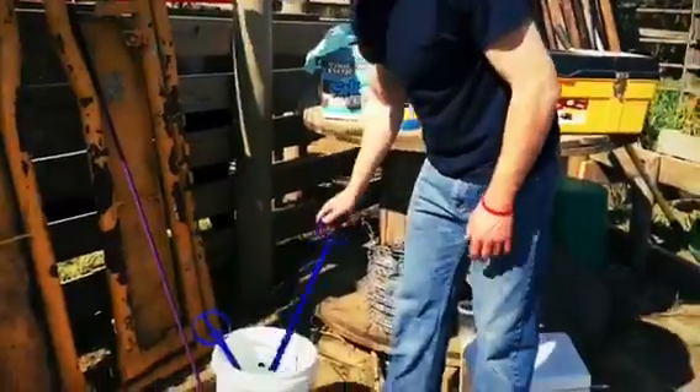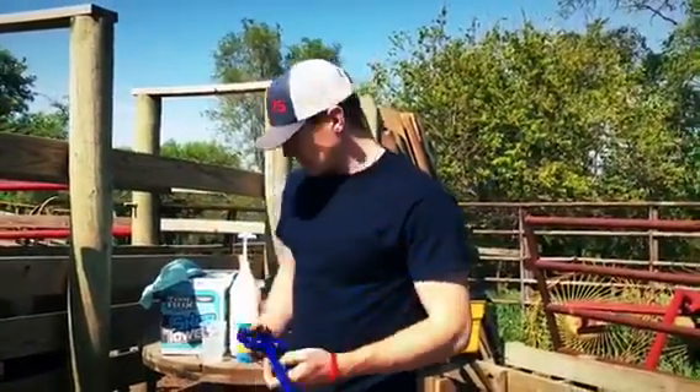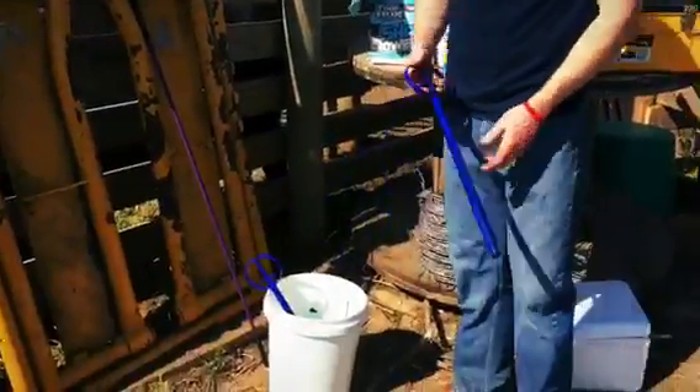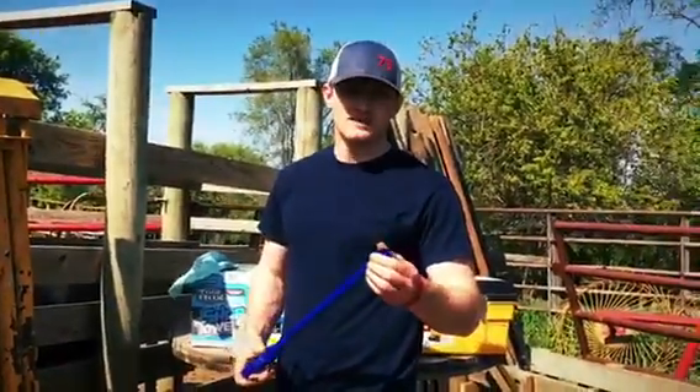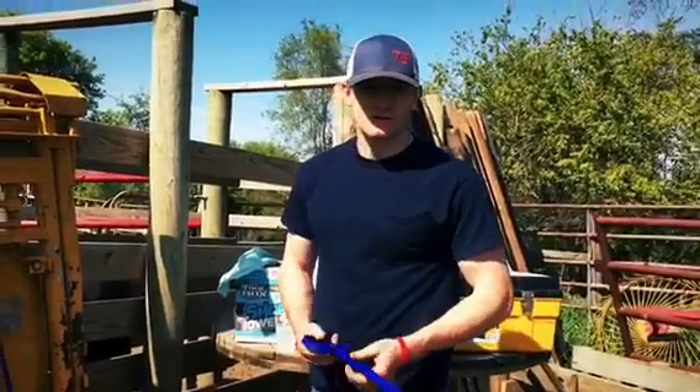Right here we have the Easy Breed CIDR applicator. I usually have at least two because they're kind of flimsy with their plastic, and you never know when one might break. Having quite a few around is pretty helpful.